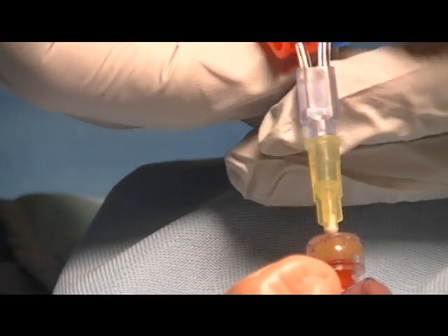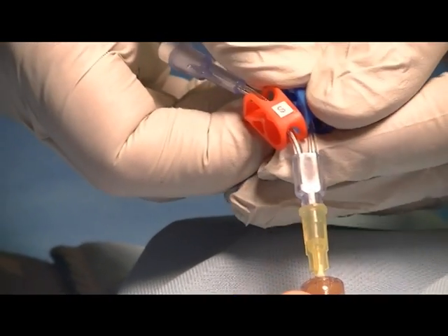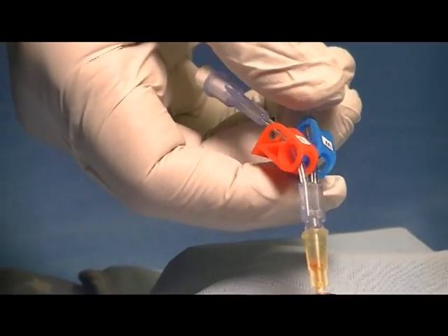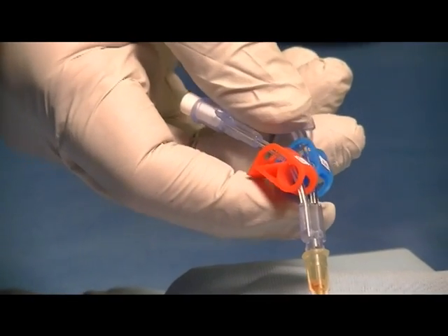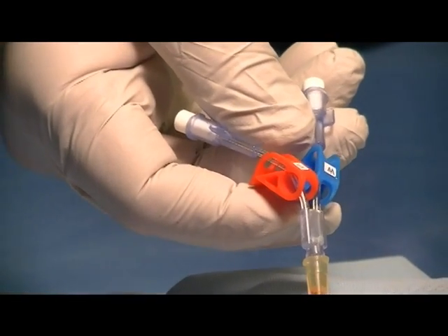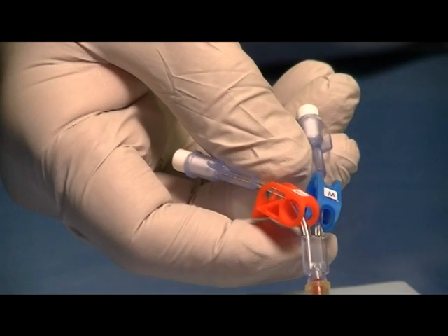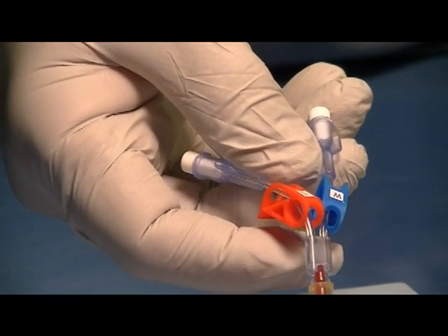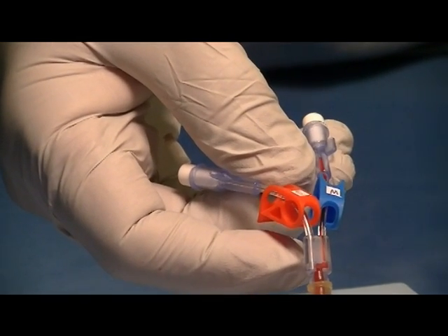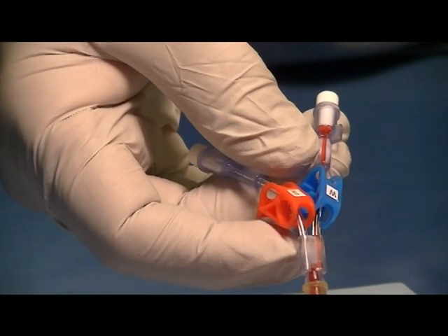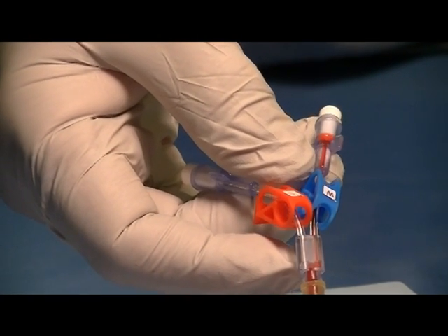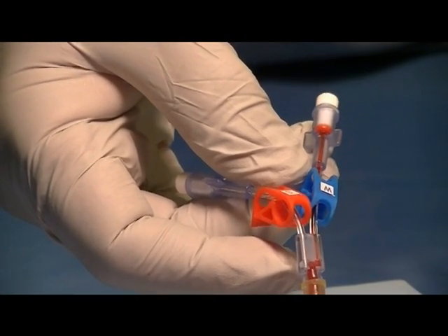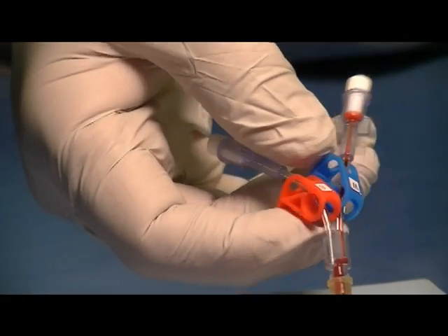At that point, release the blue clamp and allow the blood to flow from the catheter up into the waste plug until it hits the white vent plug.